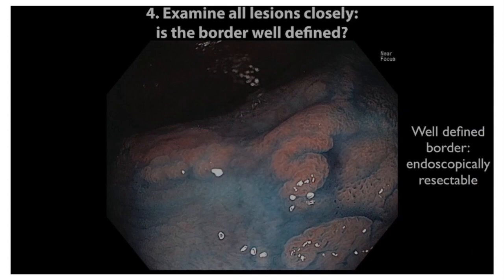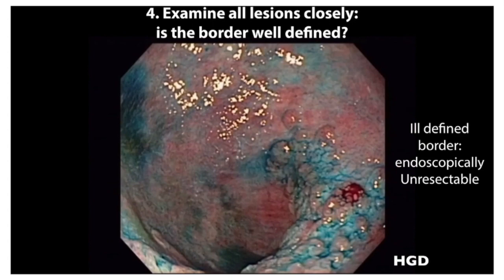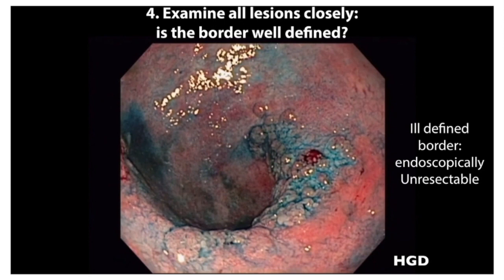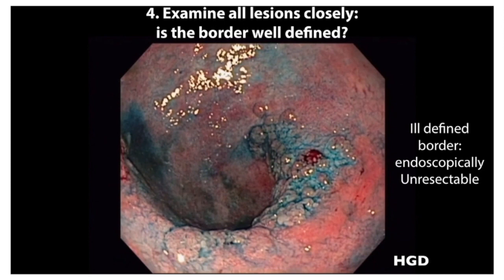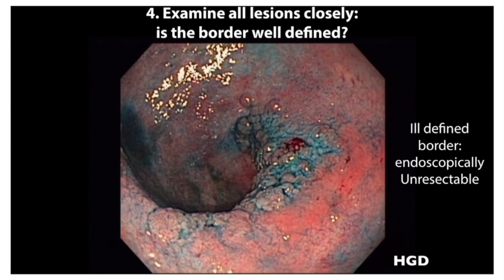In contrast to the prior case, this lesion has several features indicating it is not endoscopically resectable — it is poorly circumscribed, has an indistinct border, and has an irregular plaque-like surface with a depressed center. Biopsies confirmed high-grade dysplasia. Surgery is the best treatment.